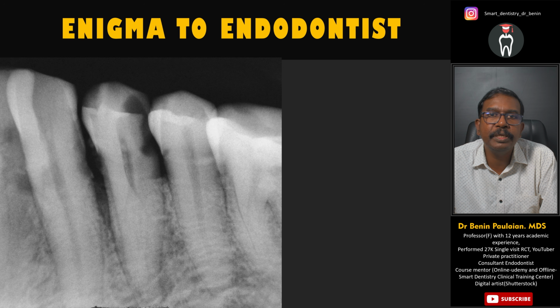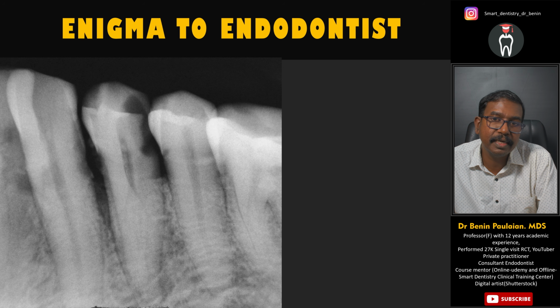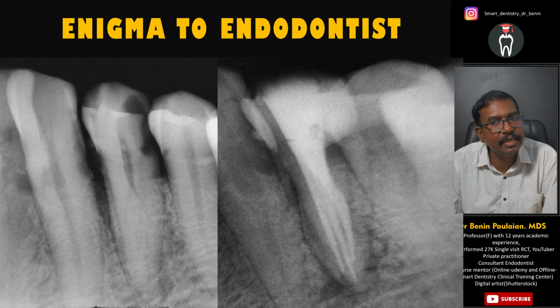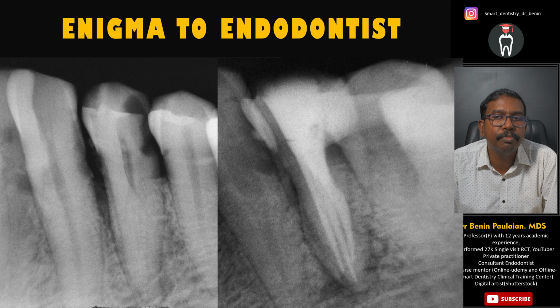The mandibular first premolars are called the enigma to endodontist because of their variety of different appearances, having one canal, two canals, three canals, and all these anomalies are quite common in mandibular first premolars. Whenever we see this fast break appearance in a radiograph, we should appreciate that something is not correct and we should pay more attention.